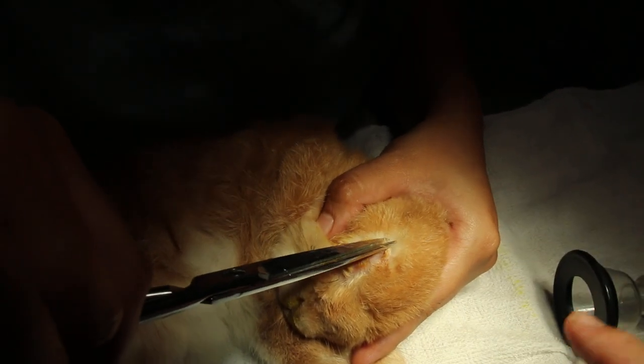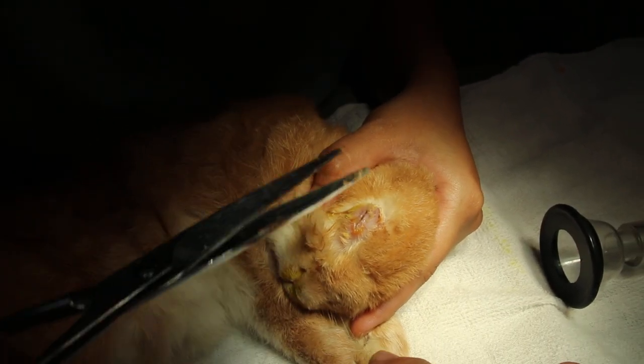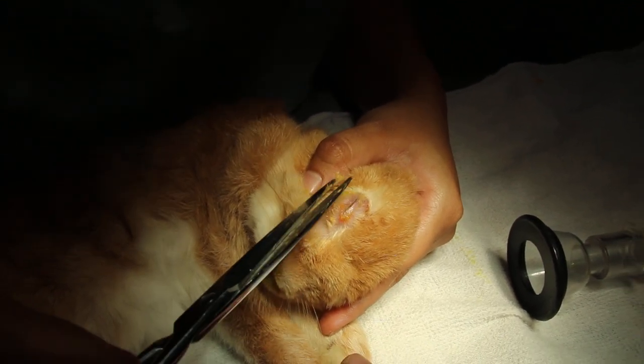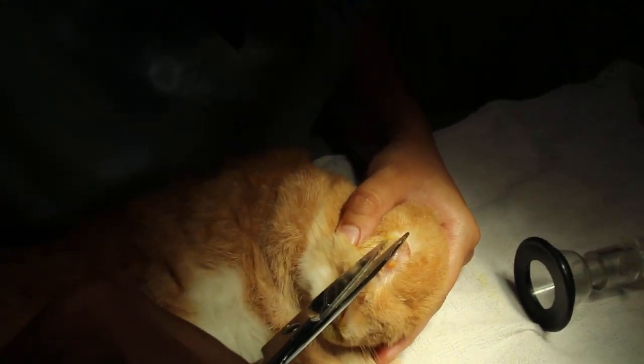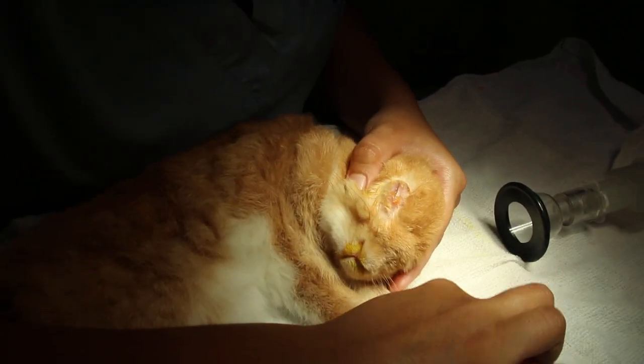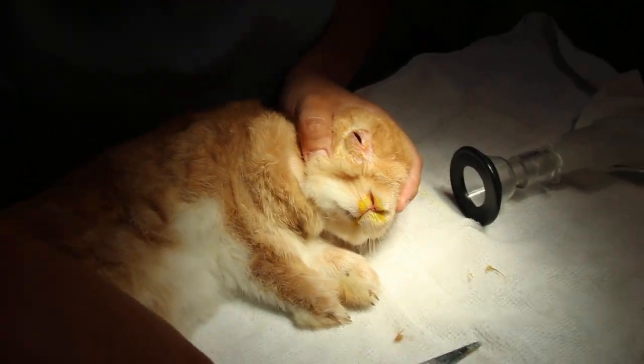It's a bit of gas, that's why it's down. It's a 5-year-old rabbit with eye discharge. I put the fluorescent drops to check whether there is an eye ulcer, cornea ulcer, but there's no cornea ulcer.